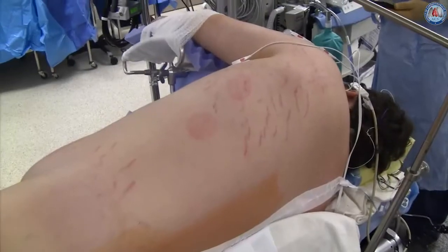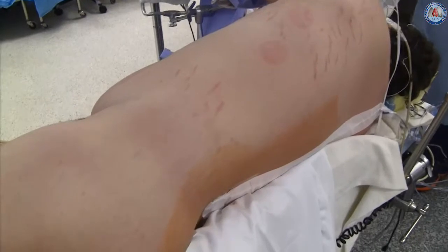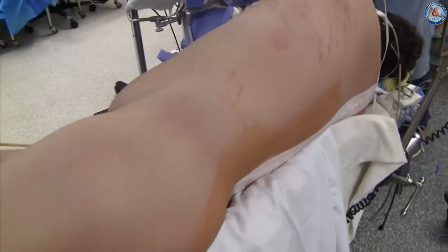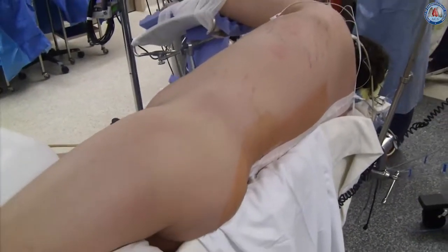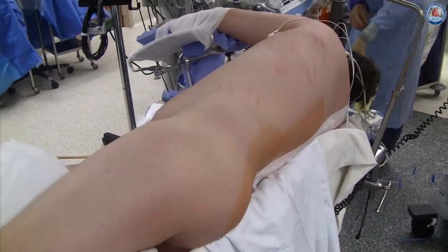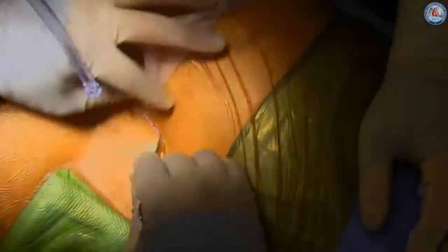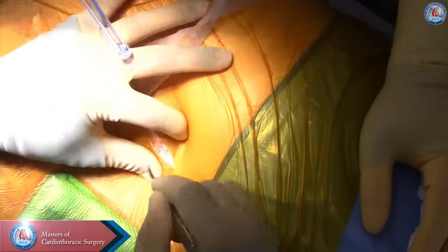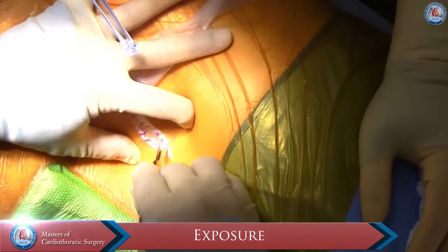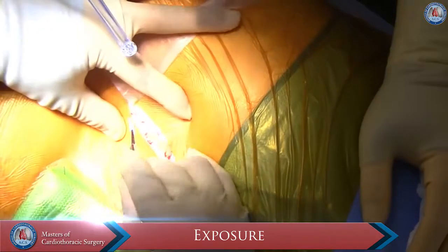The patient is positioned in a right lateral decubitus left-side-up position with the hips at 60 degrees and the chest at 90 degrees. The left groin is opened and the left common femoral artery is exposed.